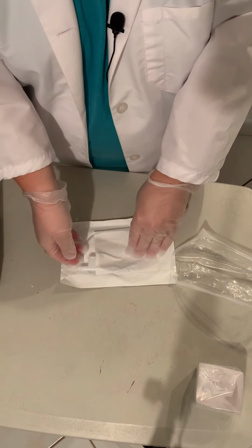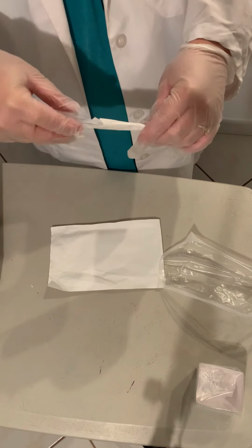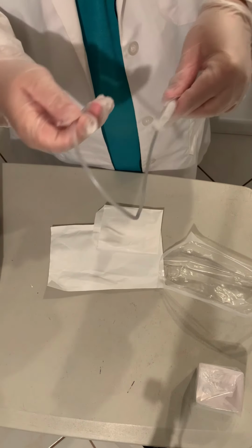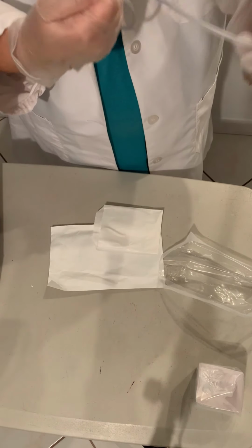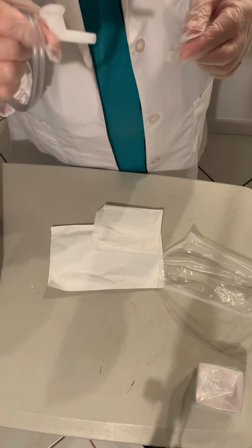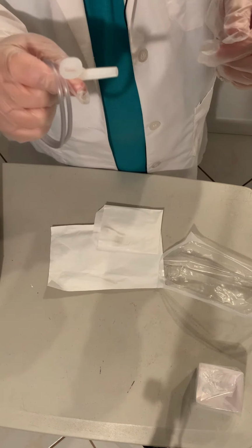And then we can come in for our catheter kit. Okay, we're going to take this out of here. We're going to start by putting the tip in our hand and wrapping it around so that we can hold this securely so we'll be able to plug it into the tubing.